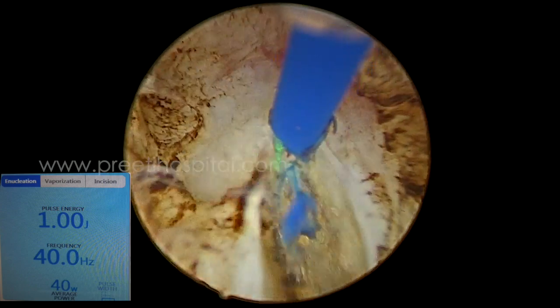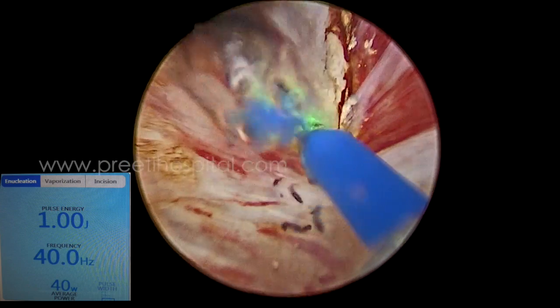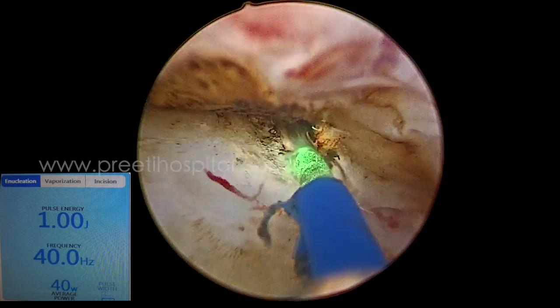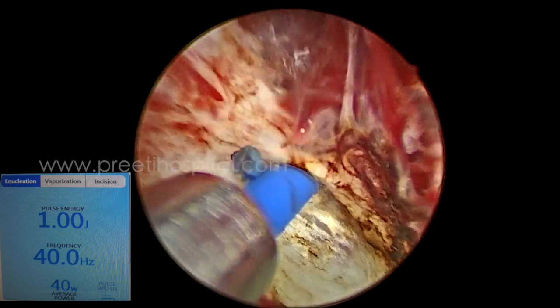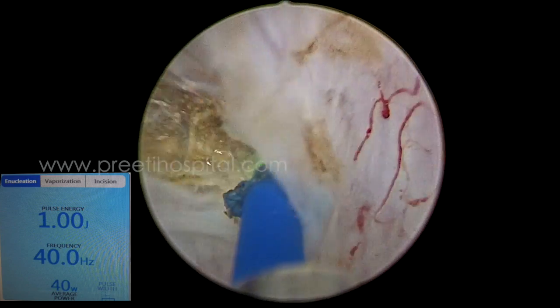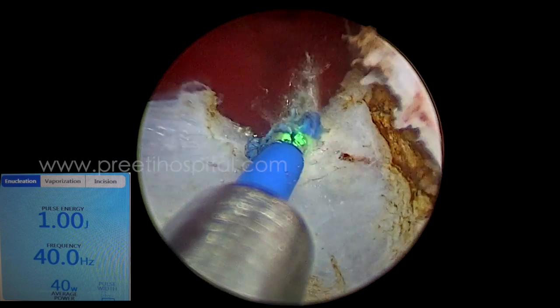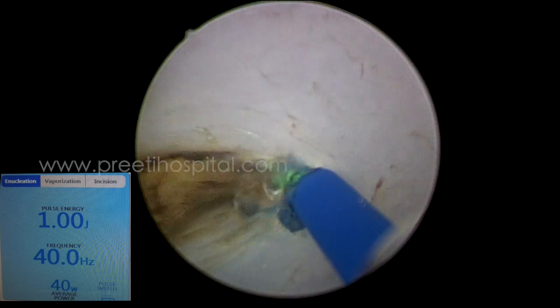When we were finishing, we might have gone into the bladder at this stage, seen the orifice, and kept away from it. But we did not realize that we were close to the trigone. This happened because we were almost on the capsule during the entire surgery, but the problem was that we were very closely removing the bladder neck region and all of the prostate tissue.